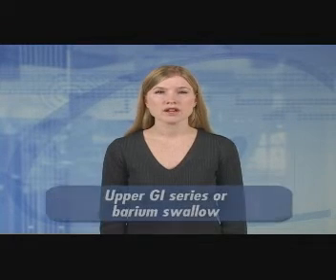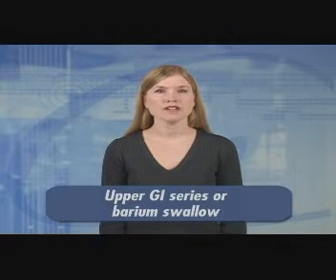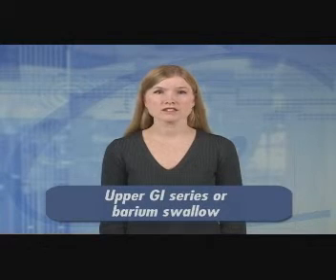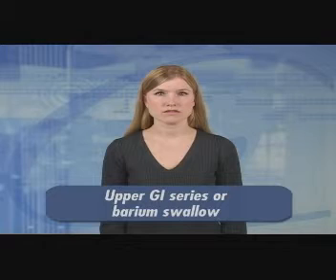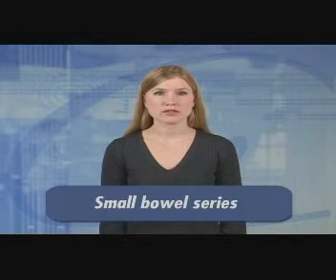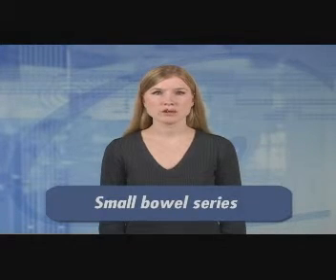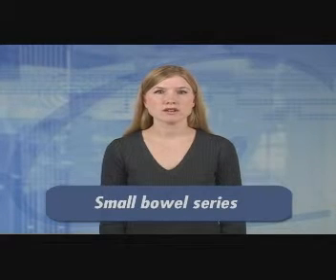Finally, there are several radiological tests that can play an important role in the diagnosis of gastrointestinal disorders. Upper GI series or barium swallow. The contrast medium is used to visualize the lower esophagus, stomach, and duodenum. It detects gastric ulcers, esophageal disorders, strictures, and tumors. Small bowel series. The contrast medium is used to visualize the small bowel. It detects small bowel disorders.